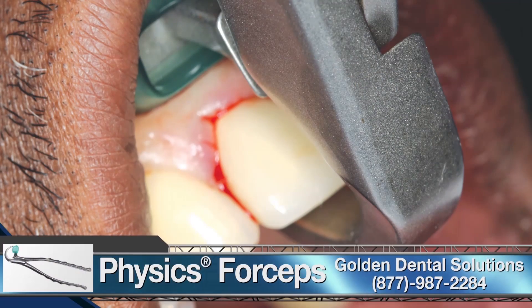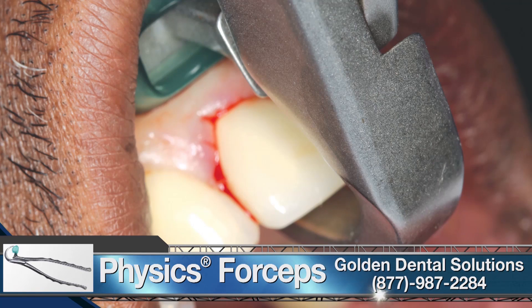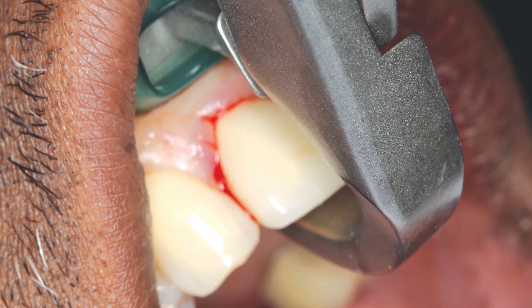Physics forceps from Golden Dental Solutions were used to remove the problematic tooth. The beak of the instrument was placed onto the palatal aspect of the root about three millimeters subgingivally. The bumper, or fulcrum, of the instrument was positioned as far up the vestibule as possible. With a simple rotation of the wrist towards the tip of the nose, the tooth was lifted up and out of the socket. The procedure was atraumatic and no harm was done to the facial bone.